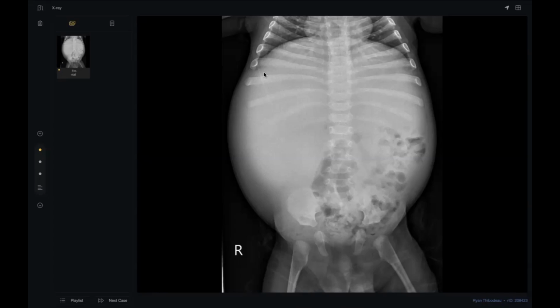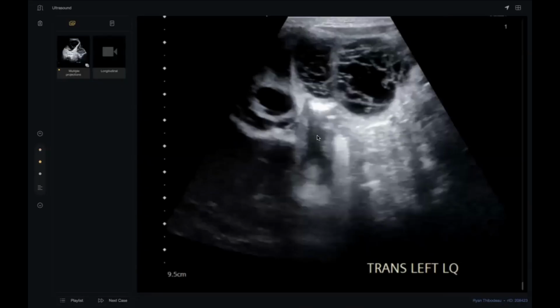What do you want to do next? Ultrasound, I will do the ultrasound as this is pediatric age group and also a 5-year-old child. Excellent, doctor. Don't rush directly, my colleague, to CT or MR. Ask for ultrasound. If the examiner wanted to give you MRI, okay, you did the exact procedure, the good procedure.